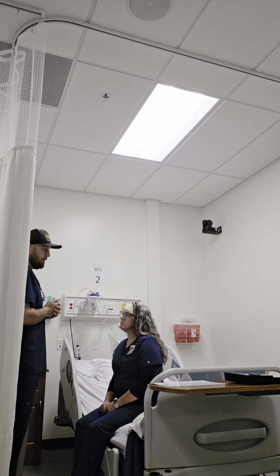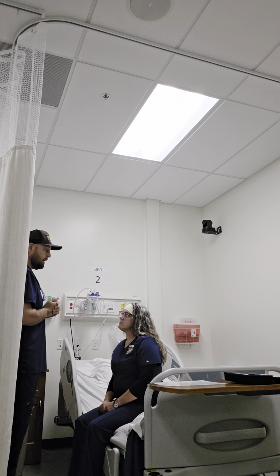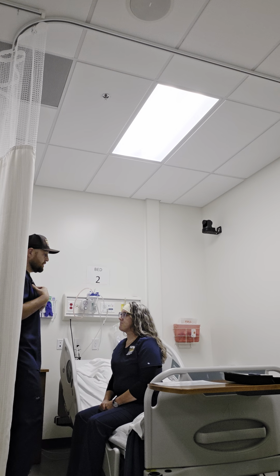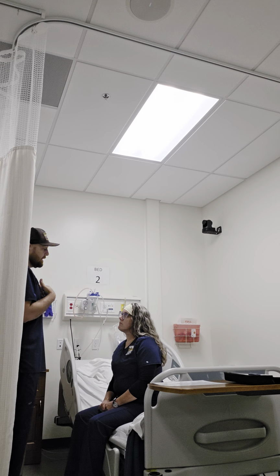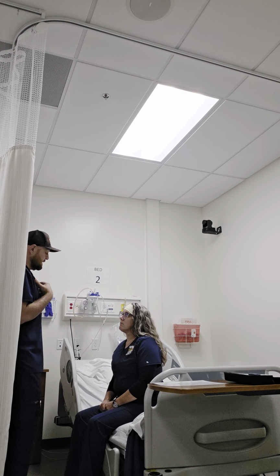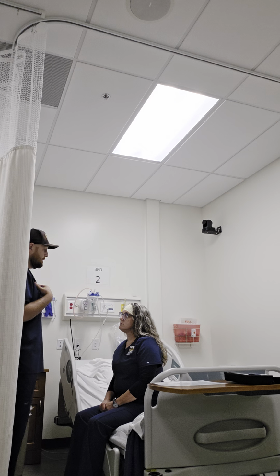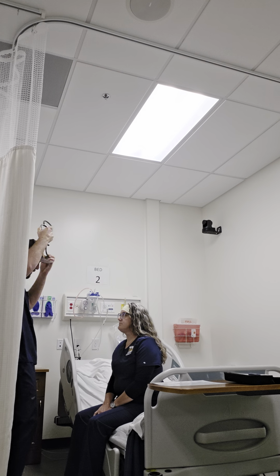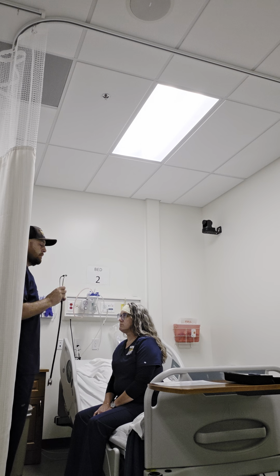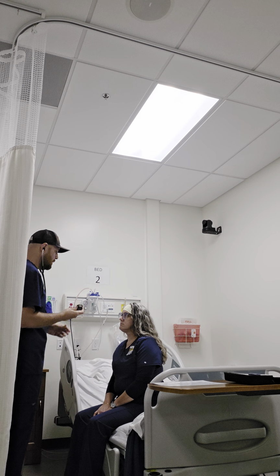Now that we've done the posterior and the anterior thorax, we're going to go ahead and move to heart sounds. Just to explain a little bit, we're first going to assess the heart sounds with the diaphragm of the stethoscope, and then we are also going to do the assessment with the bell of the stethoscope, and I'll explain what those mean afterwards.